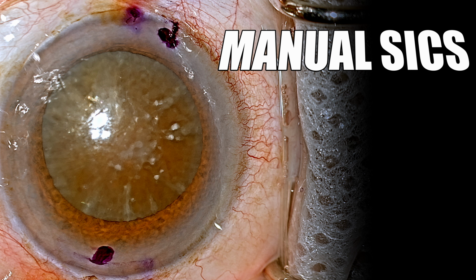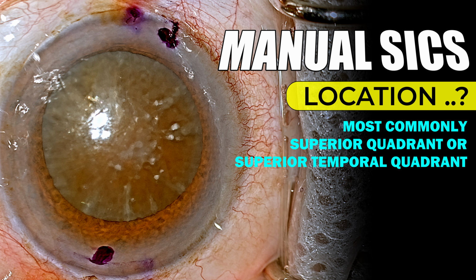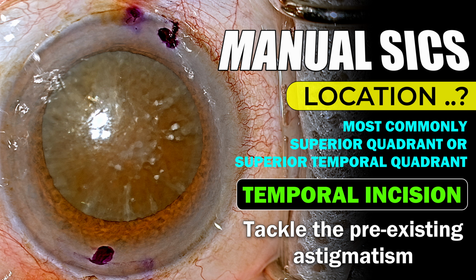And when you want to do a manual small incision cataract surgery, what is the location which you would want to choose? Now, typically, most people in India and worldwide would do it in the superior quadrant or in the superior temporal quadrant. But if you want to have the least amount of surgically induced astigmatism, doing a temporal incision is the best way. So, in my experience, even an incision of about 6.5 millimeter would not give an astigmatism more than 0.5.